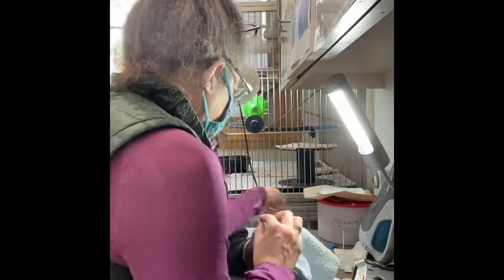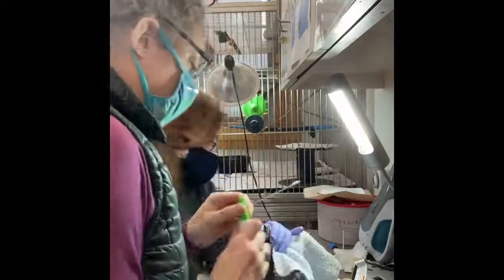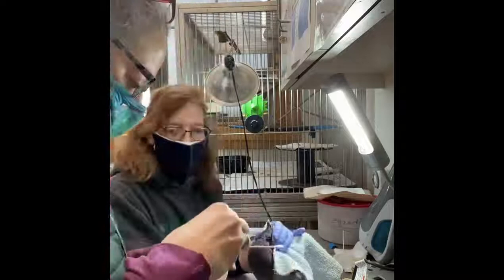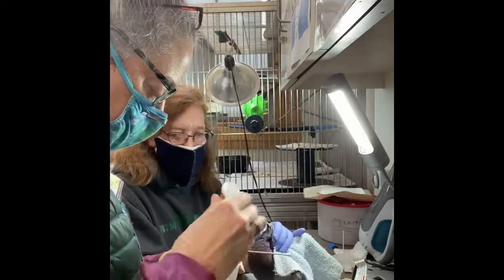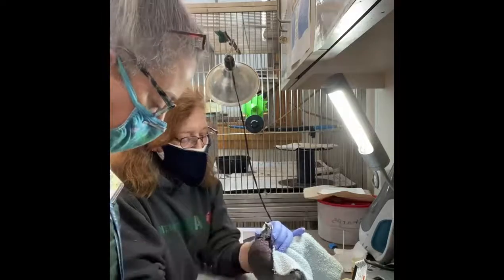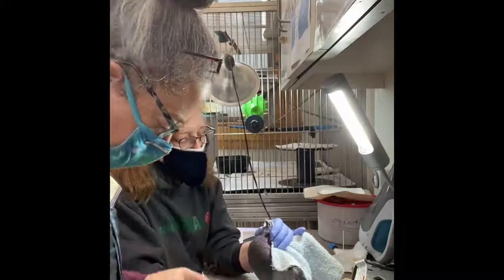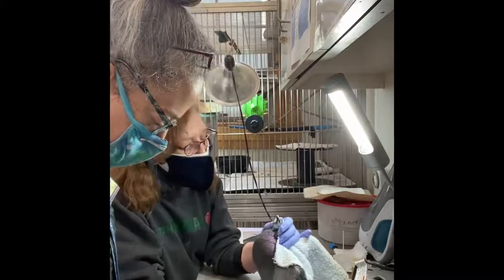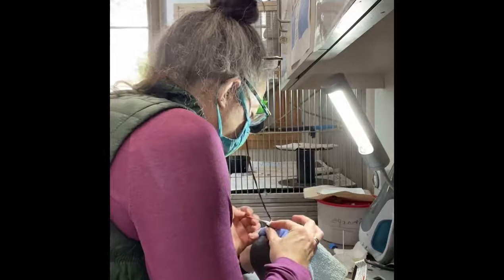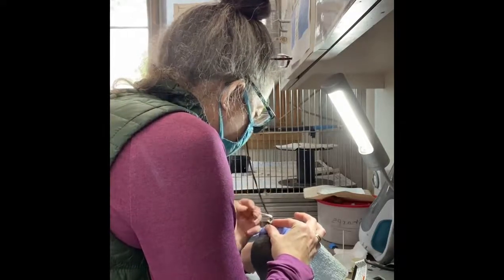It's a little wide so what I want to do is just apply a little of this on — try not to overwhelm her with it. I also have to take that little bit off so that it doesn't catch. It needs to come way in.